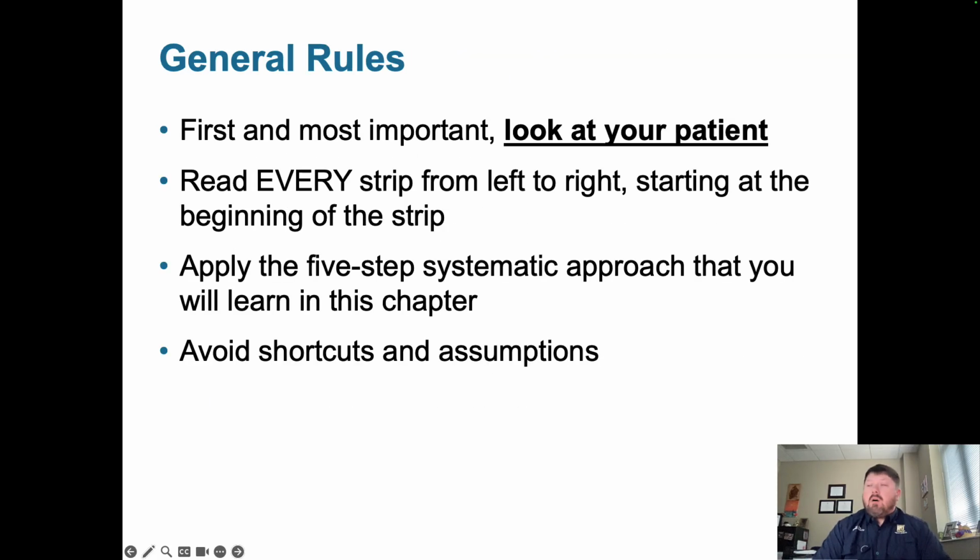First and foremost, always look at your patient. Make sure that you're taking care of your patient. Your monitor is a diagnostic tool that will be very helpful in your patient care, but you want to make sure that you are looking at your patient. Read every strip from left to right. Remember, it's calibrated so that it will essentially read the same way no matter what monitor you're getting your strip from.